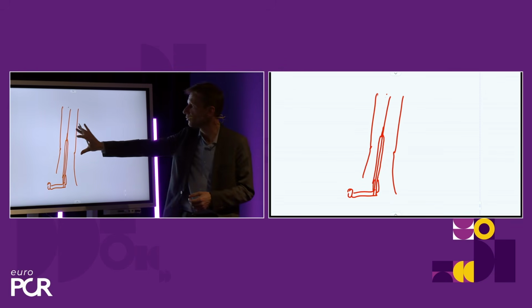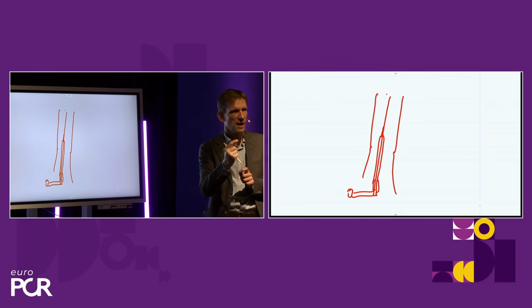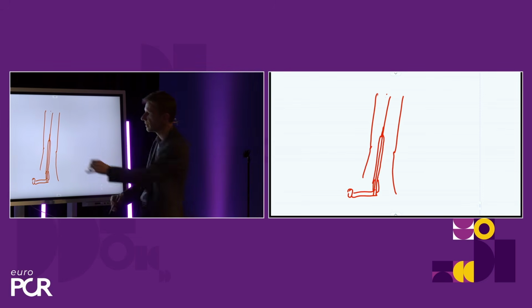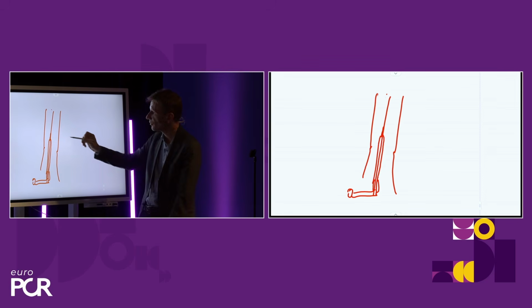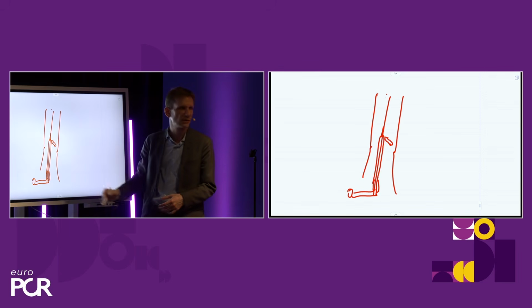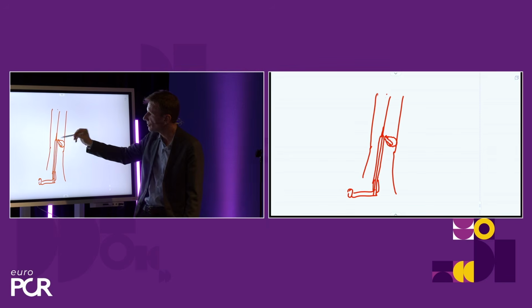You give it controlled through this 6 French sheath. You give a small angio, and then whatever you see. If you see a nice closure, you're good. Then you can take everything out and lock your sutures. If not, if you see a very minimal oozing, really minimal, then sometimes you can supplement with an Angio-Seal, even with some larger oozing.